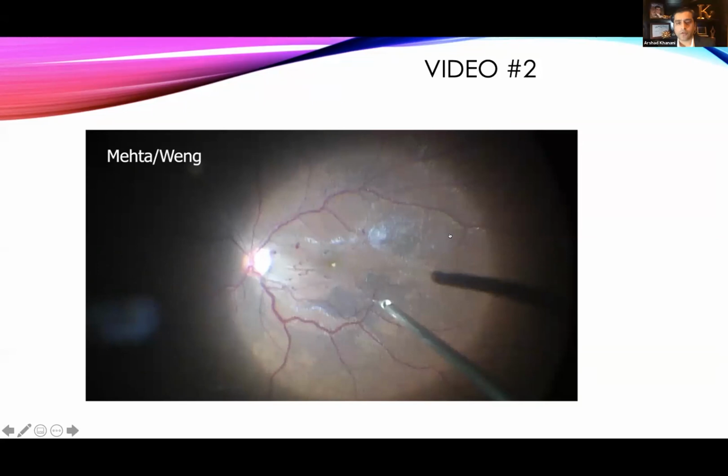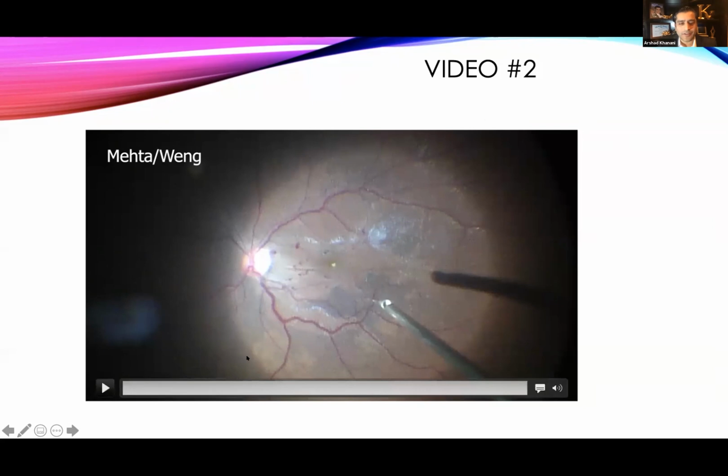So you said you only stain a maximum of twice. So you're trying to tell me you're a better surgeon than me, because I said sometimes I've done 3 or 4 times restain. Sometimes 3. If I'm doing a double peeling, yeah, I might do it a third time, maybe. You're getting back at me for that lens comment, that you dinged a lot of lenses during fellowship. I think you're trying to get back at me.